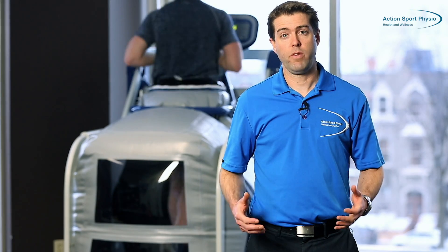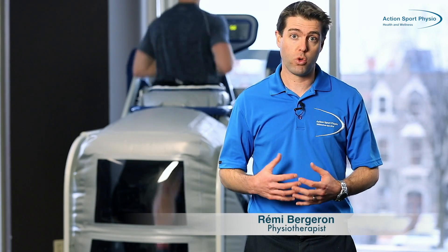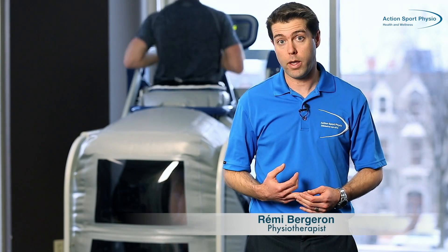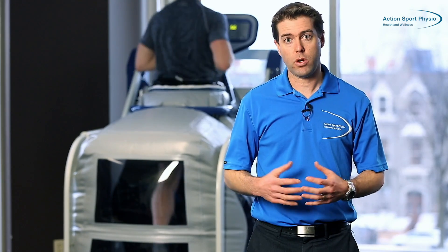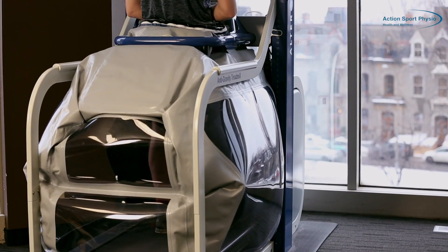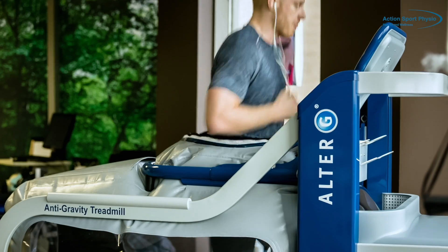The Alter-G, or anti-gravity treadmill, is a device that we can use to diminish someone's weight while they're running or walking. It combines two technologies: a treadmill, but also air pressure technology that was developed by NASA, that allows us to reduce someone's body weight while they're running or walking.